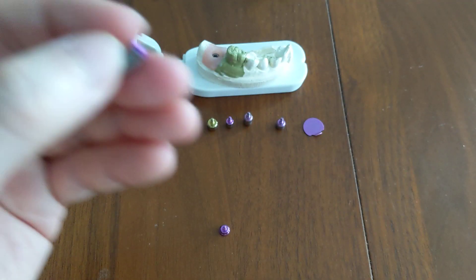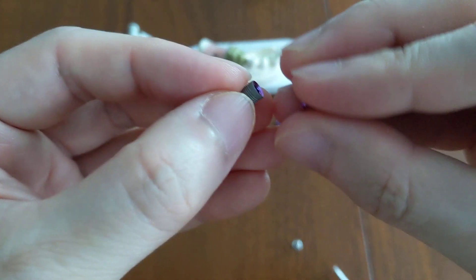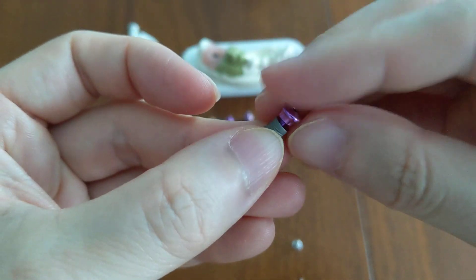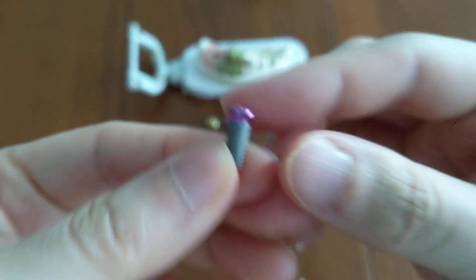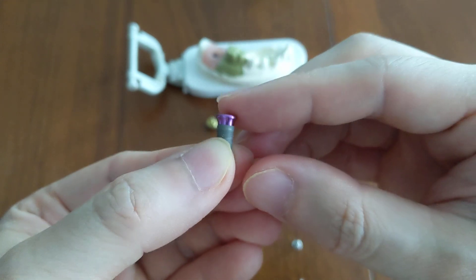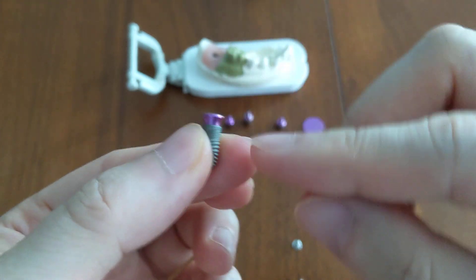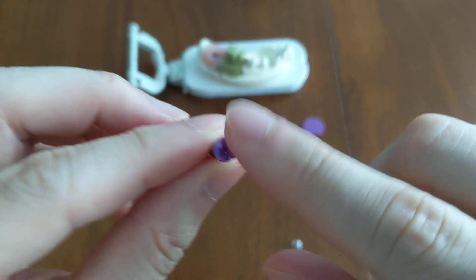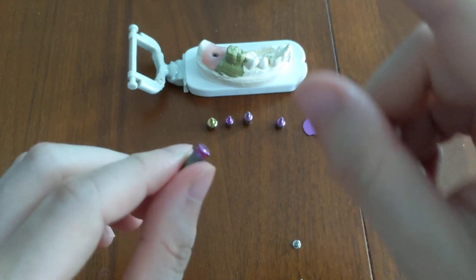Now I'll put the healing abutment on. I can just screw it in with my finger. As you can see, it makes the implant significantly taller — it is a lot bigger on there — but it still serves the same purpose in that it blocks the hole and prevents things from going into it.